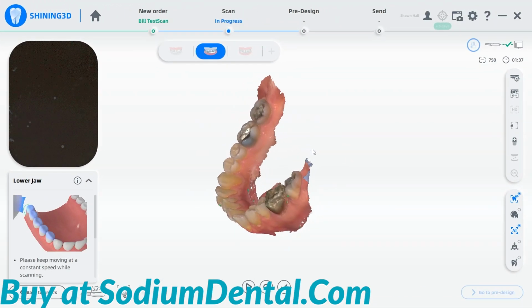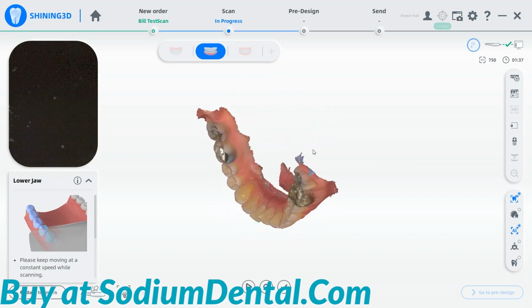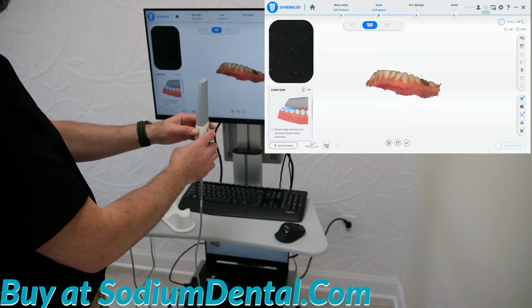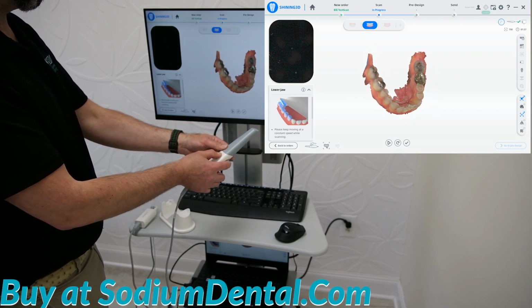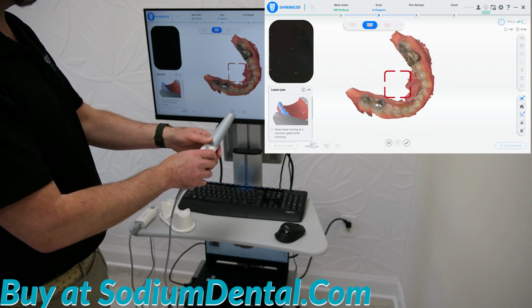Areas I have not fully filled in with data will be marked in green. Some of these areas will be unimportant to the impression scan. I will go back through by clicking the Start button. Now I can touch up those areas.